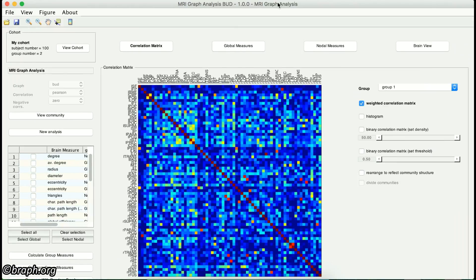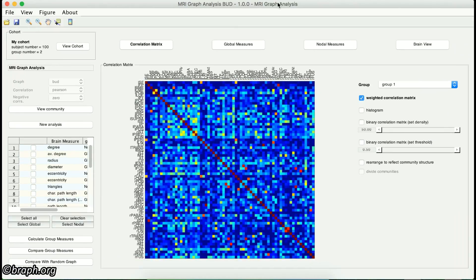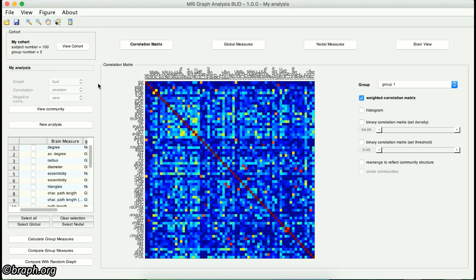As you see, the cohort panel appears in which you can see the cohort used for analysis and its properties. Also, the name of your analysis can be redefined here. Under this box, you can see the parameters you have selected for creating the connectivity matrices. If you want to see the community structure defined for the graph analysis, click on the View Community button.